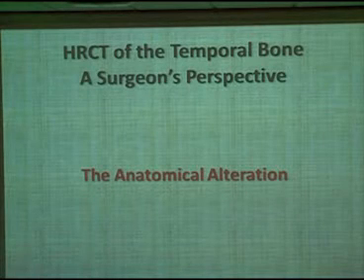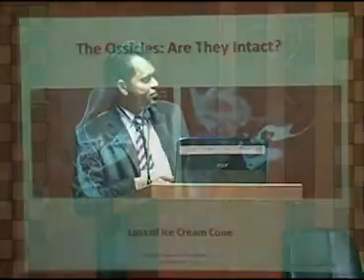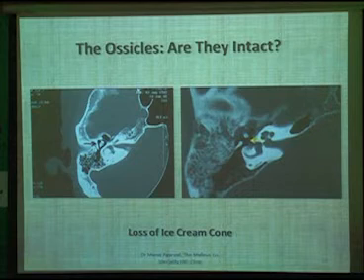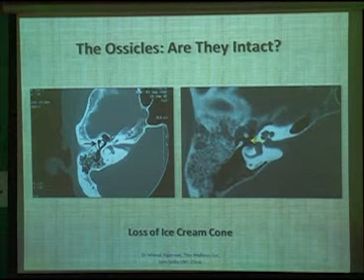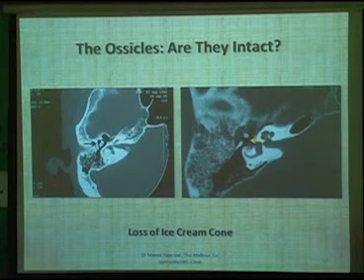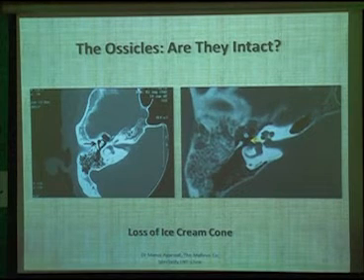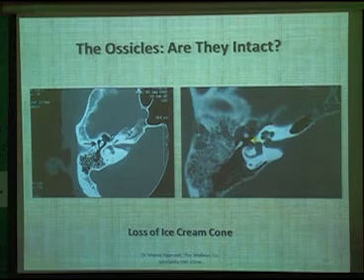That was a little bit about the anatomy. Now let's look at anatomical alterations we could encounter in day-to-day practice. We previously saw the classical ice cream cone appearance of the incudomalleolar joint as normal anatomy in the attic area. Now the incus and malleus appear intact, but the joint between them is missing, and there is soft tissue on the lateral aspect of the epitympanic area. This disruption of the ice cream cone appearance should give an inkling to the radiologist or otologist as to whether ossiculoplasty or any kind of ossicular reconstruction would be required in this patient.